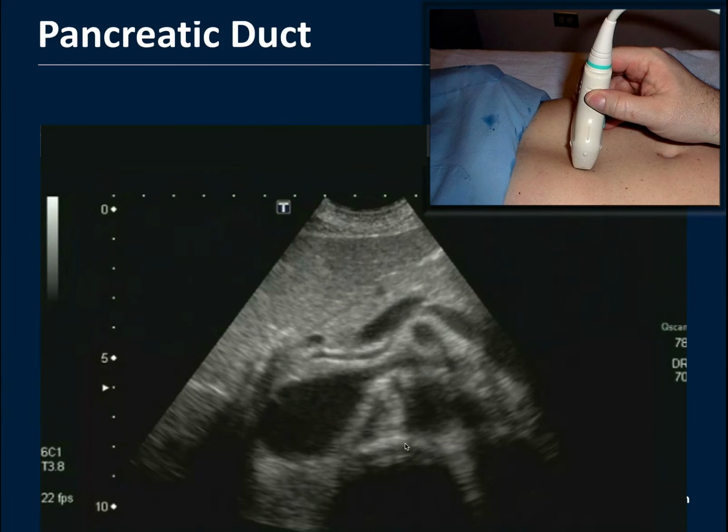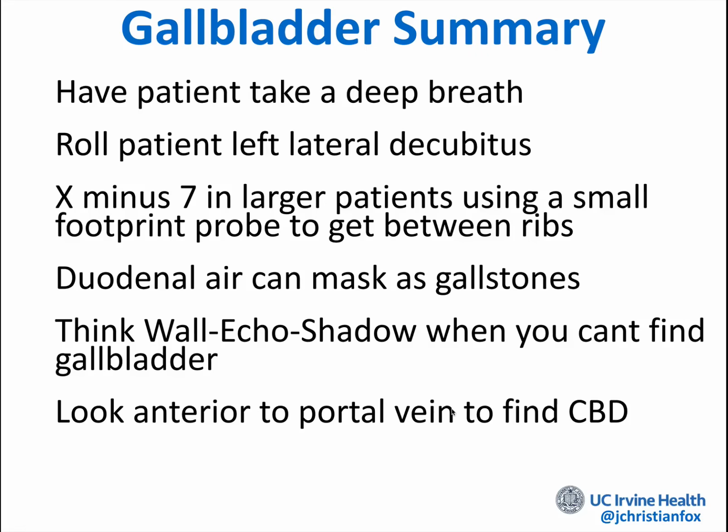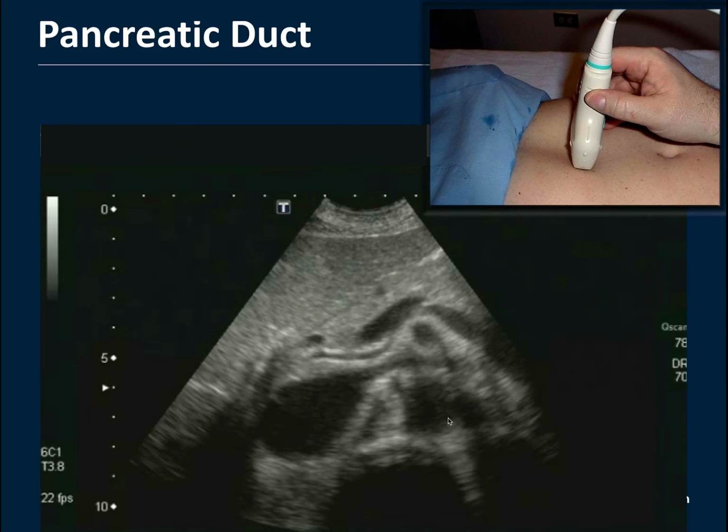Transverse plane. Once again, this is the aorta seen here. This is the IVC, the SMA. Splenic vein is crawling across here. And so this material right around here, this is all the head of the pancreas. It looks a lot like the liver. I agree, it is hard to differentiate here. But that structure right there is the pancreatic duct running inside the pancreas itself.